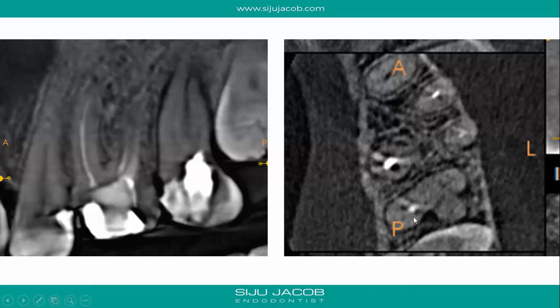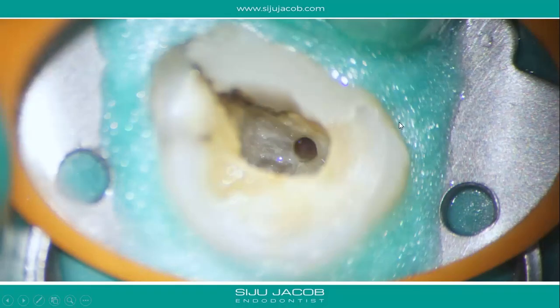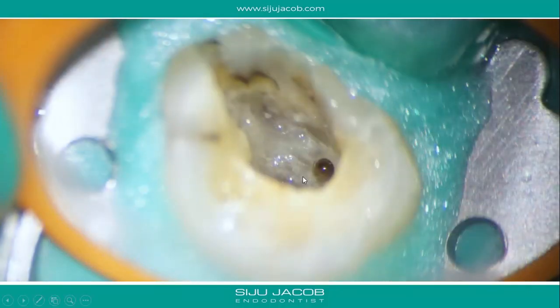With that information I had much more clarity about where to look for the remaining canals. It was clear that the canal we'd found was the palatal, and that the mesiobuccal and distobuccal canals were going to be buccal to that. So we could confidently remove the entire portion including the existing filling — there was also some secondary decay there — and start cleaning up that area.